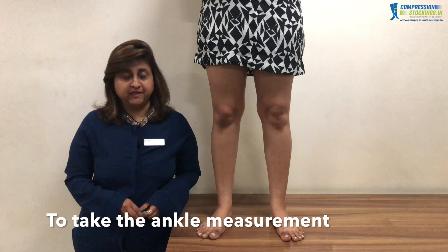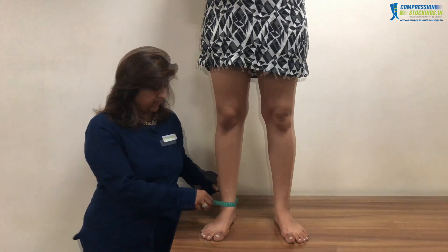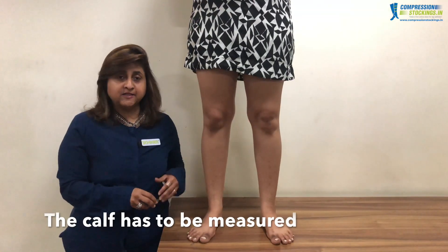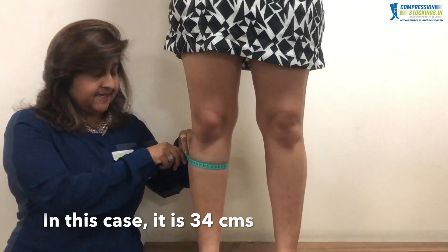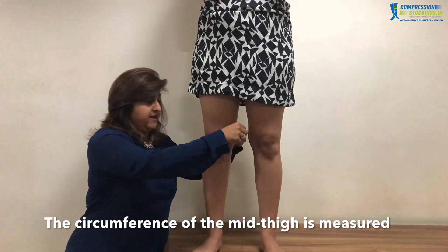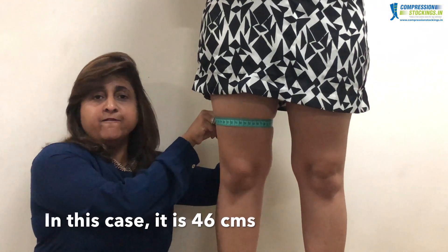To take the ankle measurement, the circumference of the ankle is measured at its narrowest part — in this case it is 22 centimeters. The calf has to be measured at its broadest part — in this case it is 34 centimeters. The circumference of the mid thigh is also measured — in this case it is 46 centimeters.